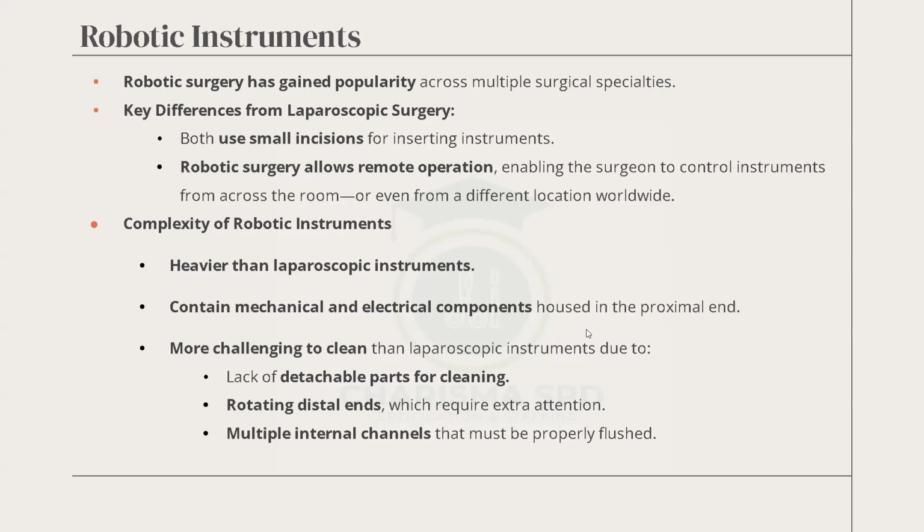They are definitely more challenging to clean than laparoscopic instruments due to the lack of detachable parts. You cannot detach or disassemble a robotic instrument. Then there are rotating distal ends. They rotate, you can wind it. And there are multiple internal channels.